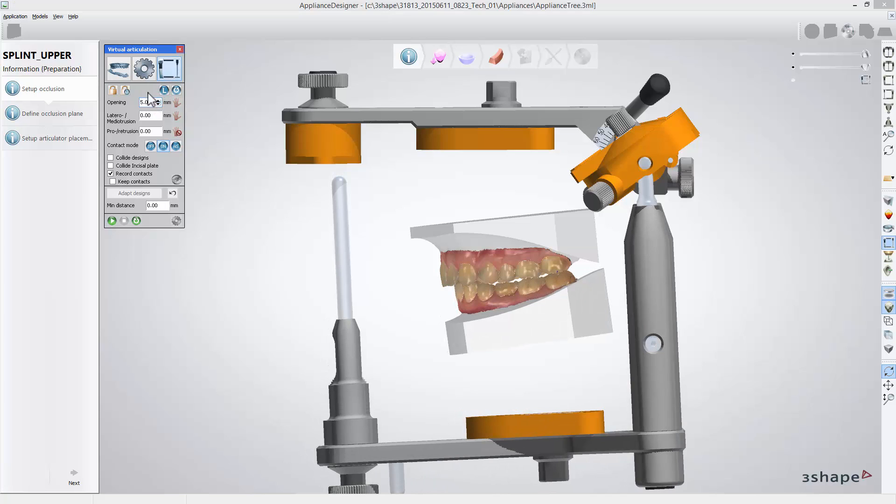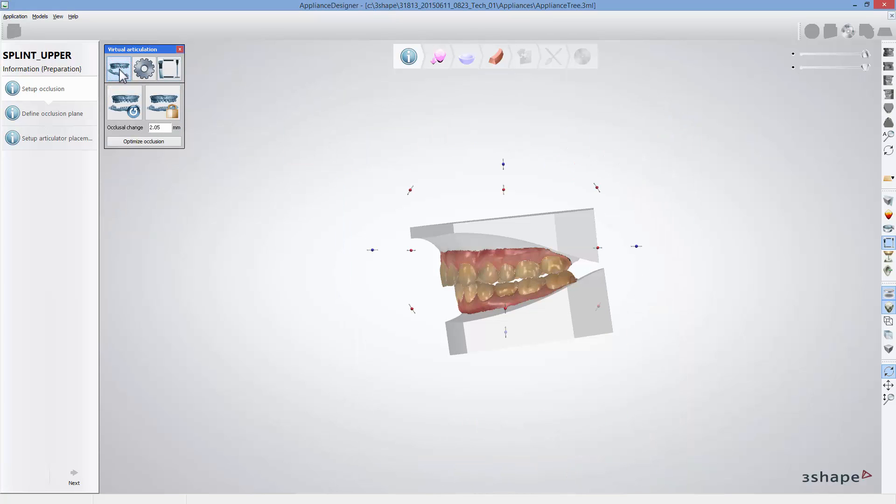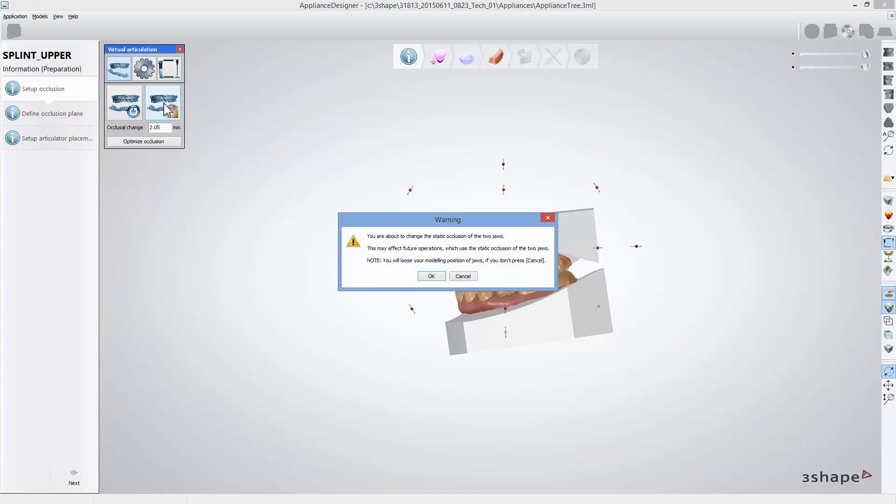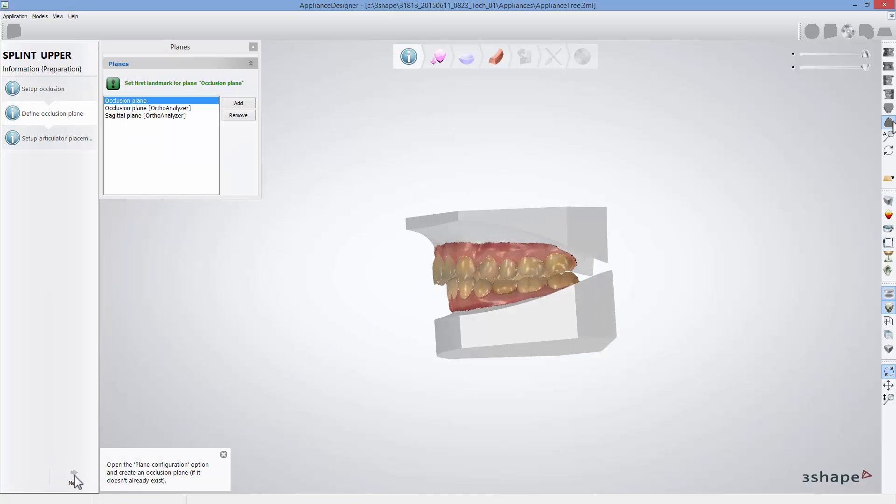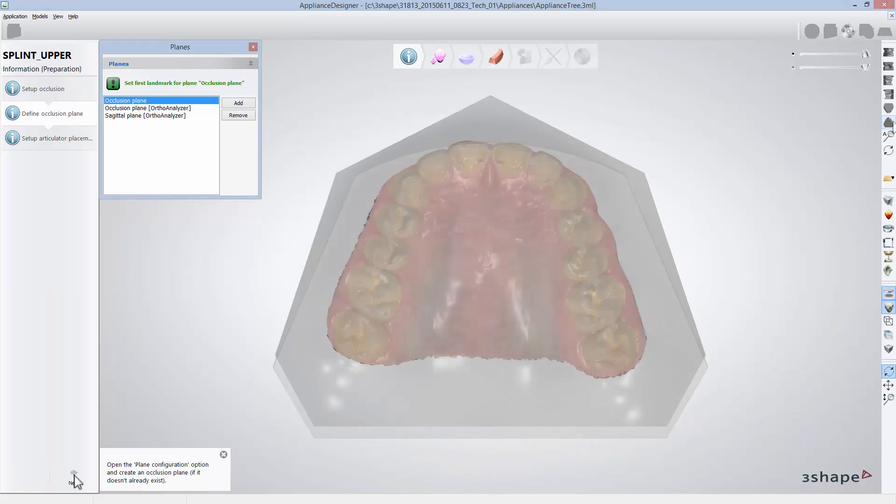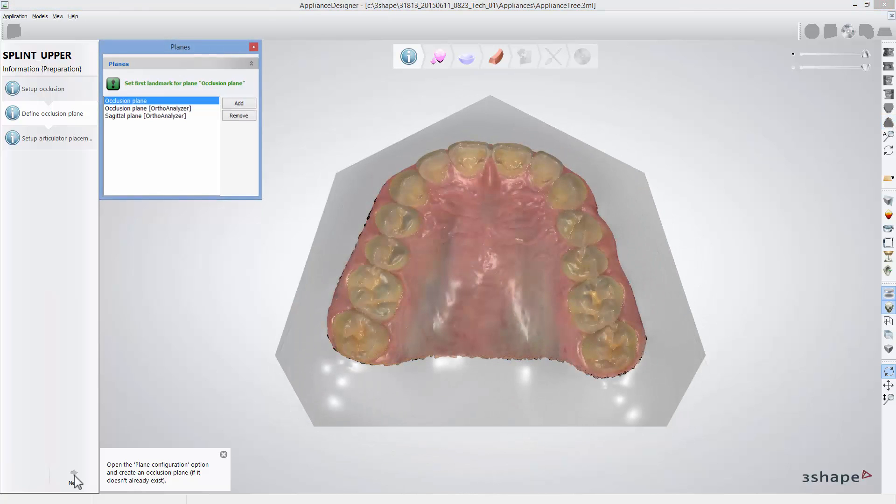Then go back to modifying the alignment to see the actual opening between teeth and click log the current alignment to keep that position during design. Once you have set a new static occlusion, click next to get to the define occlusion plane step.